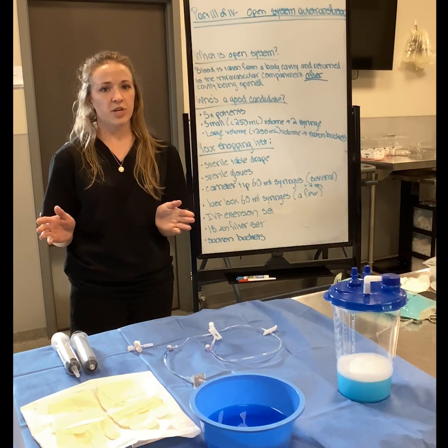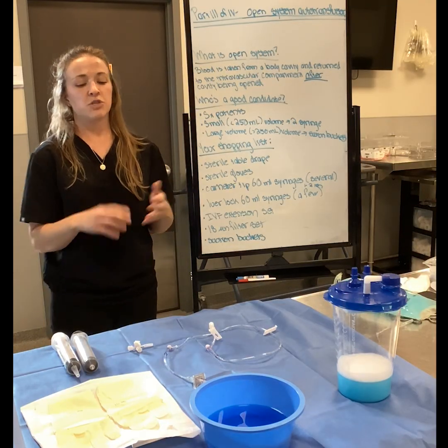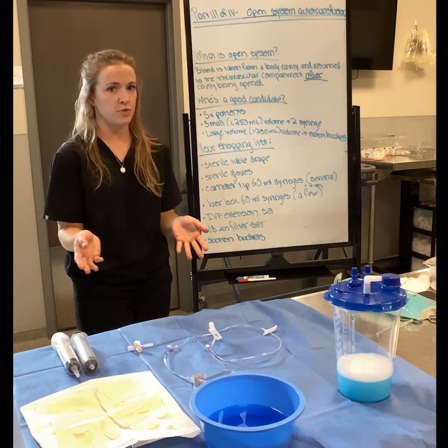So in the first two lectures, we talked about theory, and then we talked about how to do a closed system autotransfusion. So now I want to show you the two different methods that I use on the clinic floor in order to accomplish open system autotransfusion.